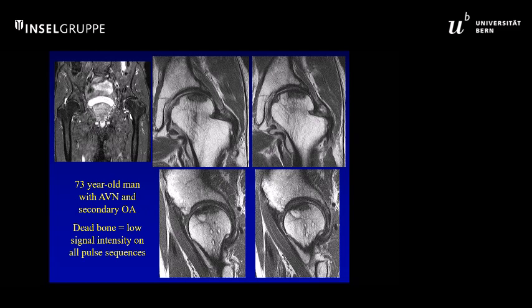We've done some work with perfusion analysis, and I would say that most of the time that's not really necessary. If I can't move water on it, it's not going to bear up to any kind of restorative technique and will have to be debrided.